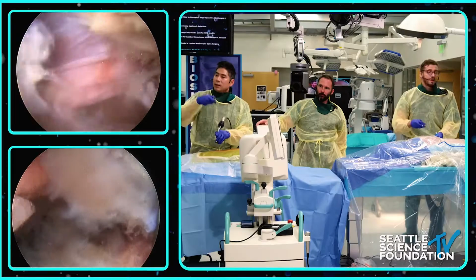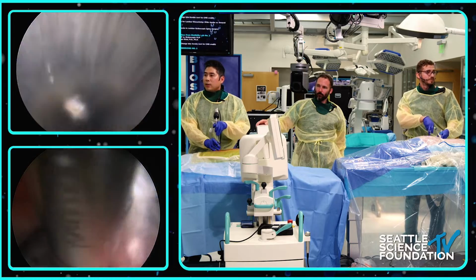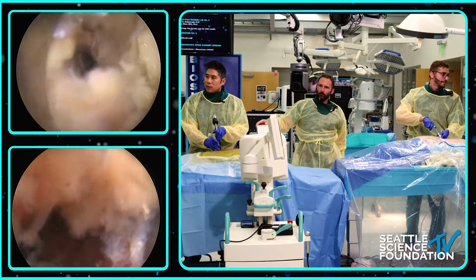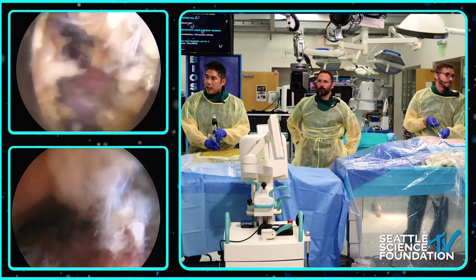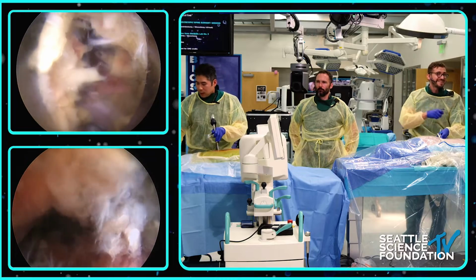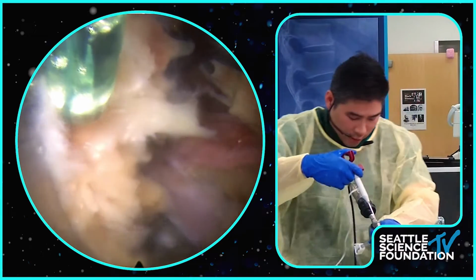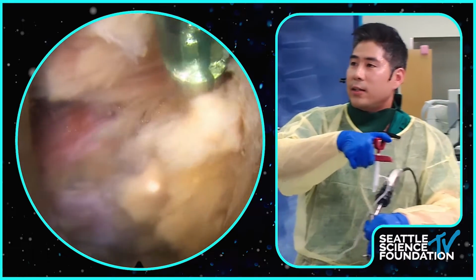John, how are you looking with the interlaminar? Yeah, so great. I don't know if you guys can all see. I'm going to come out a little bit superficial so I can show the lay of the land. So that's the hole that we made in the annulus. This is the lamina above. This has a little bit of ligament still attached here. And then this is the yellow ligament.